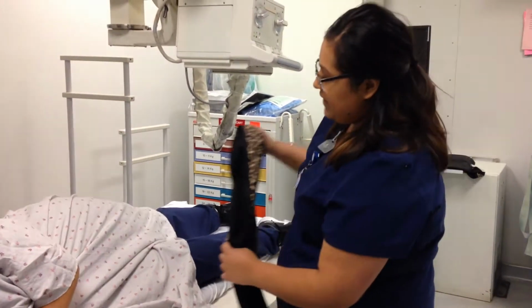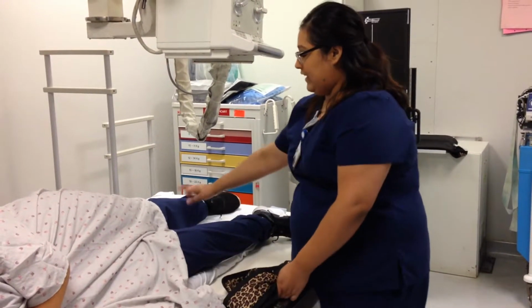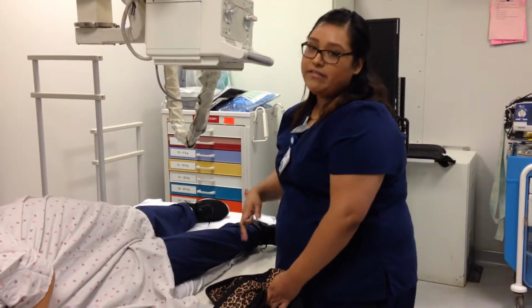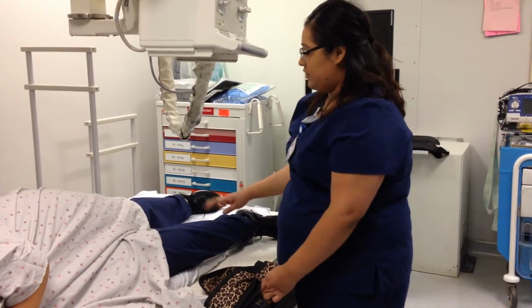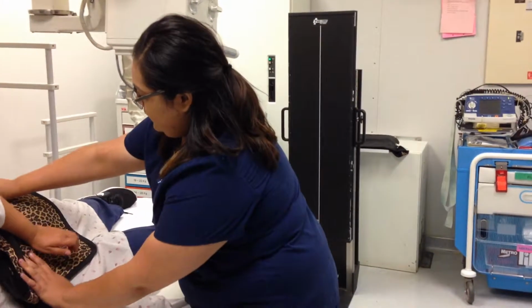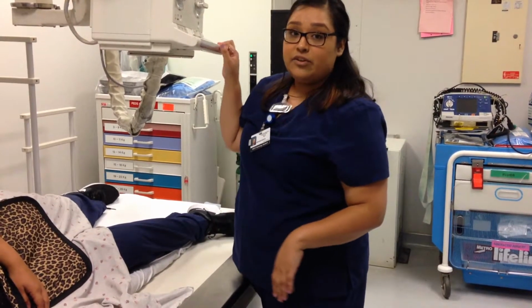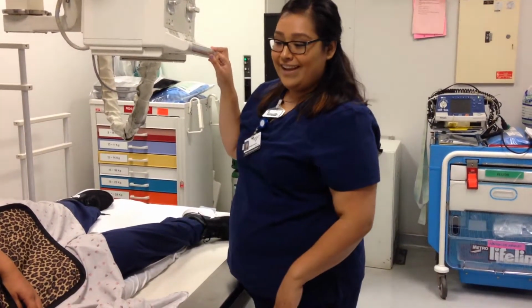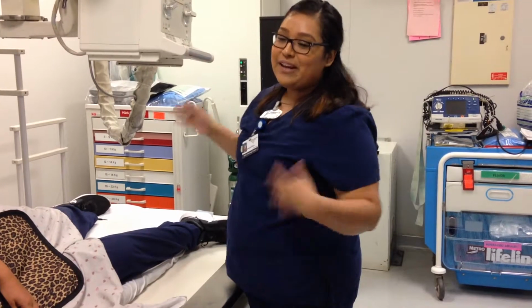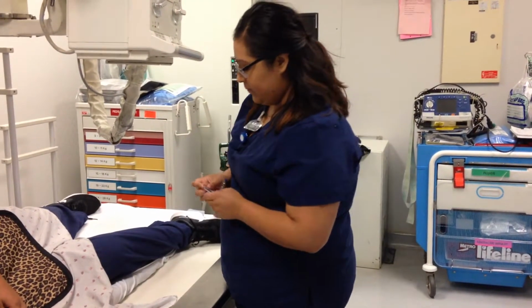And then based on how the patient positions themselves, you can have the unaffected leg behind them or in front of them, and the patient here has chosen to leave that leg behind them, and adjusting our shield here. And for the image, we'll be needing a 5 to 7 degree tube angle towards the head. And since we already used a 5-degree angle for the last projection, we'll just keep it the same as a 5.